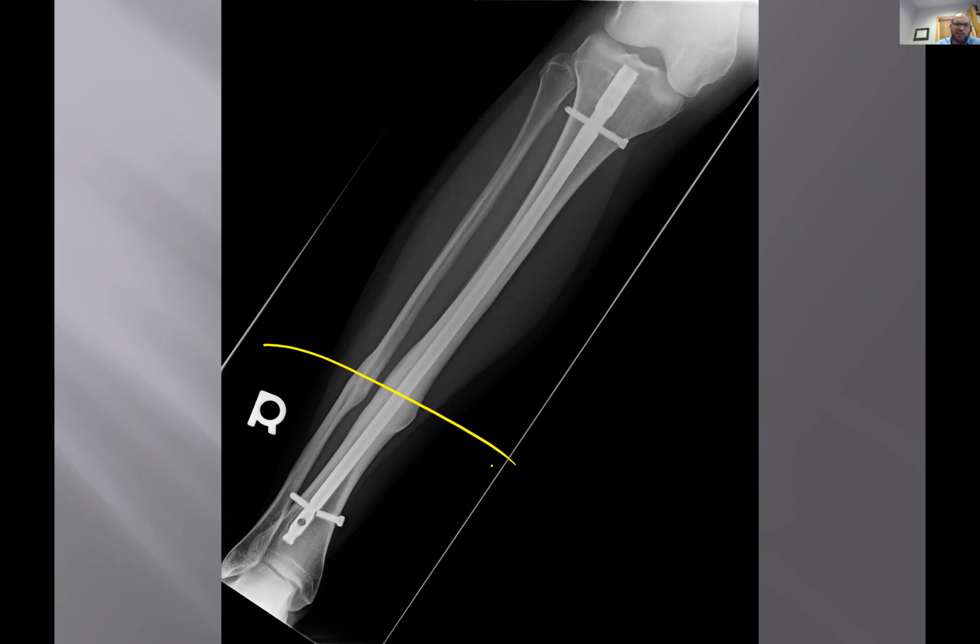I mean, this had to hurt. I don't know if you've seen the movie, but some would call this a misery fracture, but I'll let you Google that another time. Anyways, nasty fracture. In fact, I believe a variant of this was that Boston Celtics player who really did a number on his ankle last year.